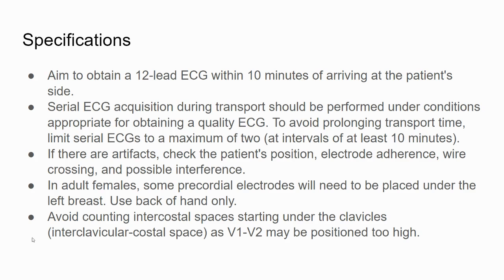If you're out in public, maybe it's not such a good idea to expose a person's chest, unless you really, really have to. You can use blankets, and there are other tricks, like a privacy curtain. But if not, always make sure to expose the chest as minimally as possible. Don't just leave your patient bare-chested for the entirety of transport. Expose them to put the electrodes on and get your 12-lead ECG tracing, and then cover them back up with a blanket or their shirts.